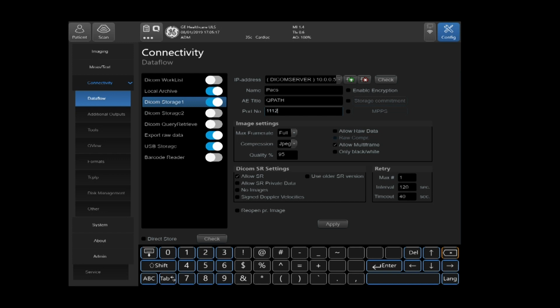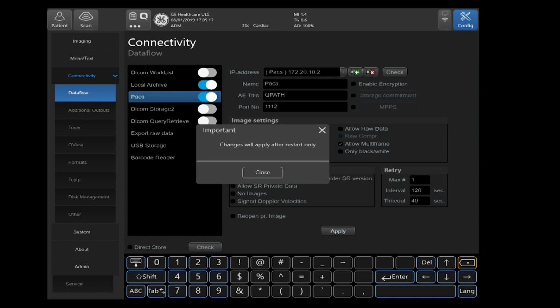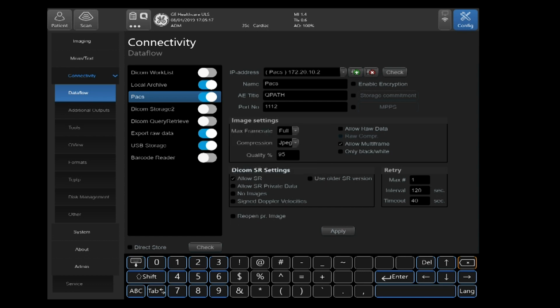Then go back up to your IP address. We're going to go ahead and select the PACS IP address we configured in the previous tab. Then you can go ahead and select apply. And you will have to go ahead and reboot your system. After you reboot your system, you're going to go ahead and go back to your PACS, highlight it, and select check at the bottom of the data flow column.